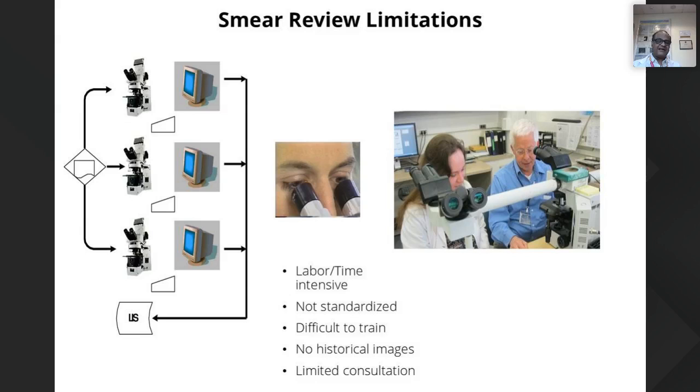Next, you cannot have a delta image check. Now, what do you mean by a delta image check? Suppose you have identified, on the first visit, a patient with leukemia. You have identified that XYZ has leukemia and the blast cell count is about 40%. After the chemotherapy, the same patient's blood sample comes to your laboratory again for the peripheral smear. We should have a historical check to understand what the blast cell count is now and what the blast count was before. So that becomes the delta check.